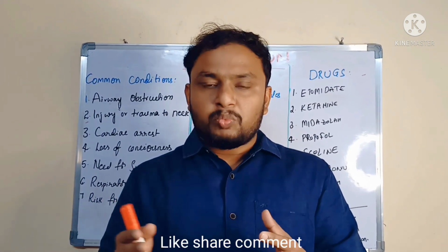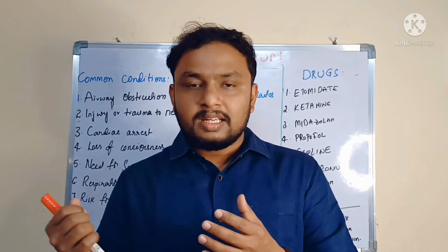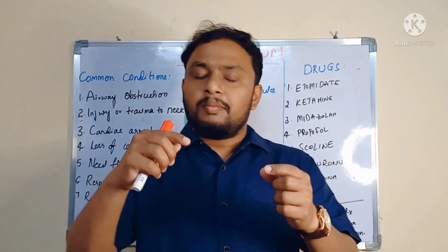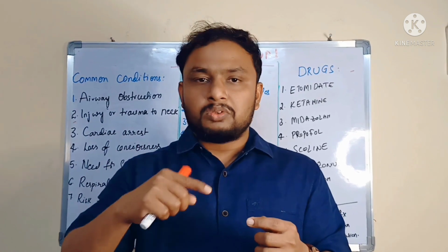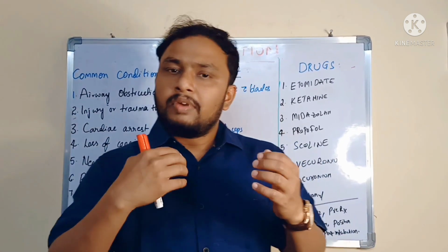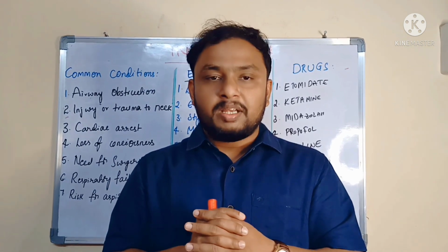It's a life-saving procedure, we can say, when a person is not able to breathe spontaneously. In such cases, a doctor inserts a tube directly into the trachea through the mouth, and connects the tube to the ventilator. The ventilator gives the breaths. This procedure is called endotracheal intubation.